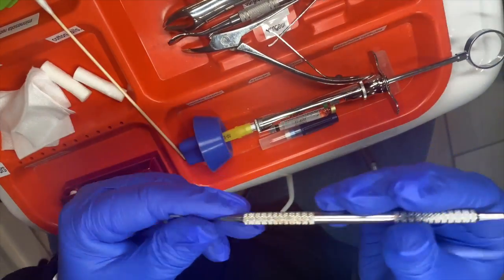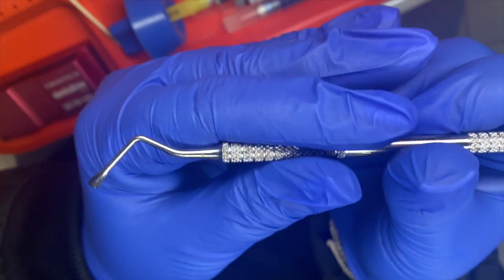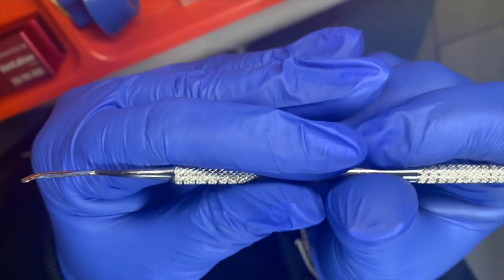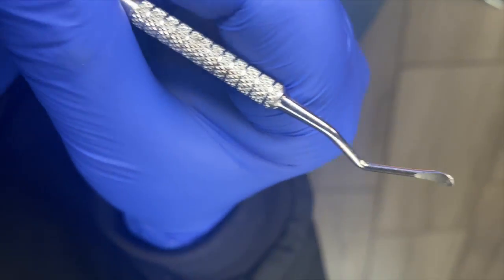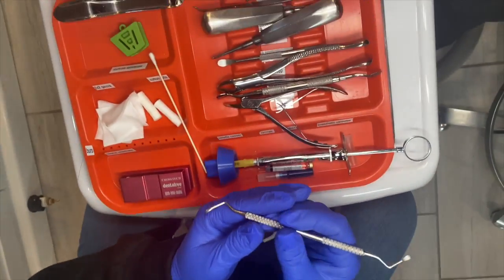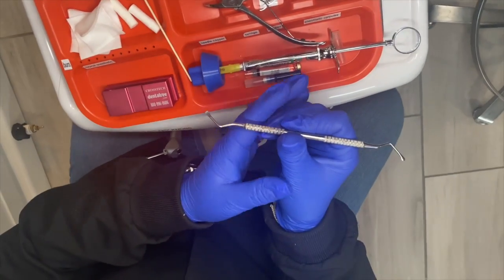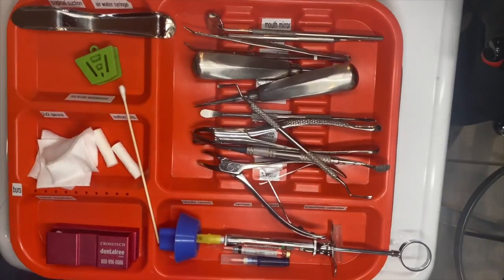This is our surgical curette — it looks like our spoon excavator, with two different sides of the spoon. It is used to remove cysts, granulation tissue, anything that is inside the surgical site that should not be there.